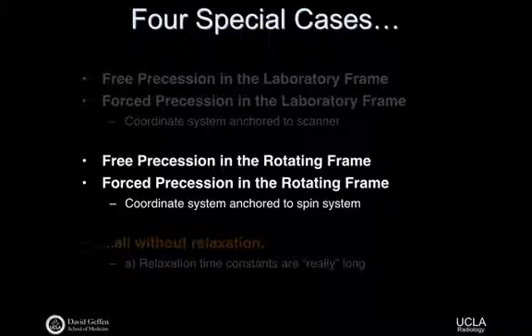Right, so that was just our expression, the equation of motion in the rotating frame. Now we can plug in, we know what the B field term is after the gamma over there. So we end up with, not an interesting solution, but good to work through it for thoroughness. We have m rho cross gamma times 0.